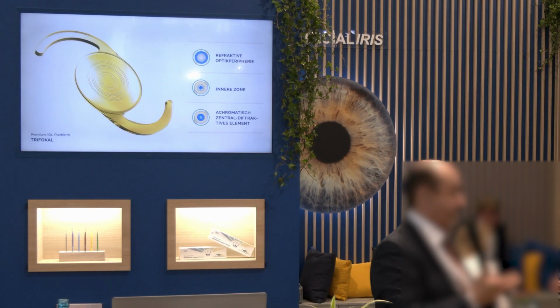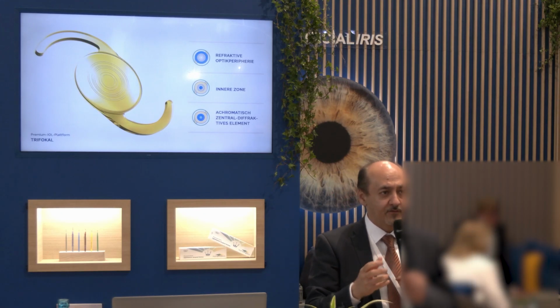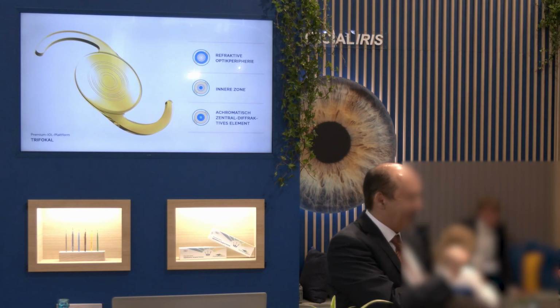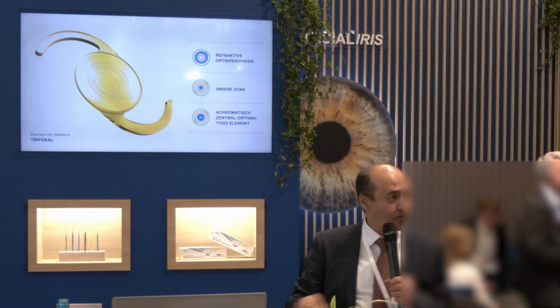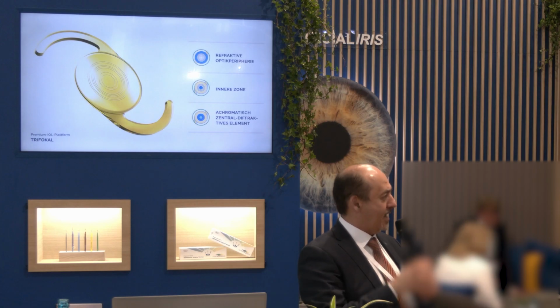This means incorporating the advantages of refractive optics, both multifocal and monofocal, along with diffractive optics. These are the three areas I showed you earlier. Each has its advantages, and now let's see how we can combine all three benefits.